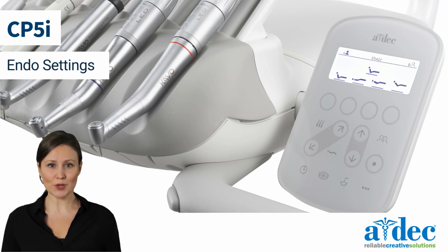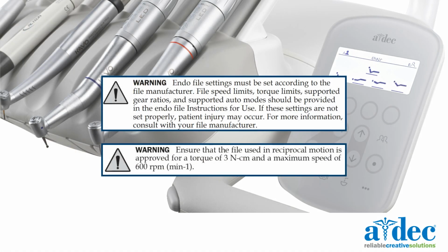In this video, we will discuss adjusting Endo settings on a CP5i control pad. Warning: Endo file settings must be set according to the file manufacturer. File speed limits, torque limits, supported gear ratios, and supported auto modes should be provided in the Endo file instructions for use. If these settings are not set properly, patient injury may occur. For more information, consult with your file manufacturer.